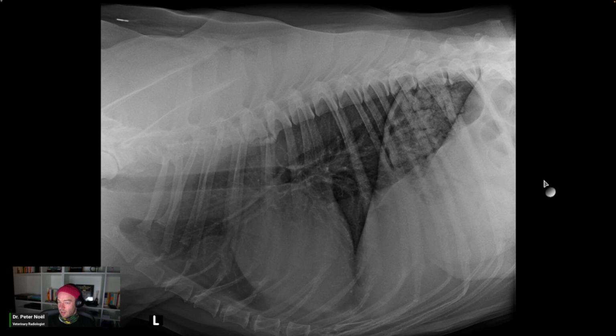And they were finding clinically relevant cases of cardiac tamponade in patients that lacked the globoid shape. So don't always say, "Oh, there's no globoid shape, so there's no pericardial effusion." That's not going to work.